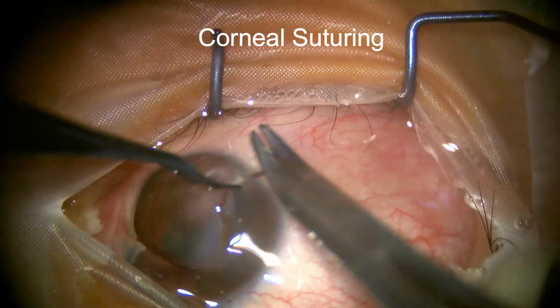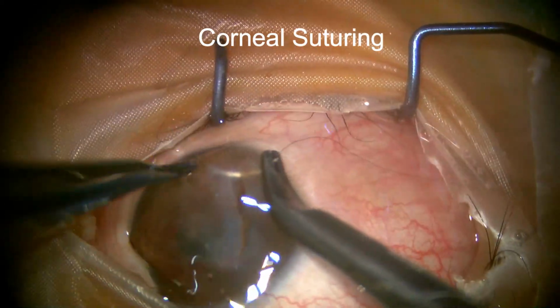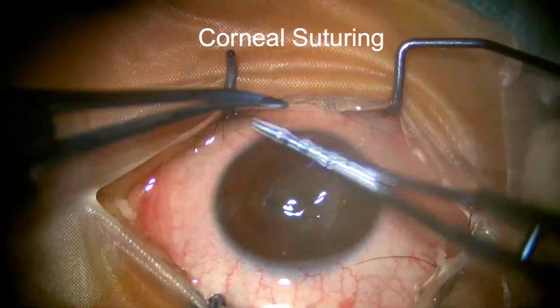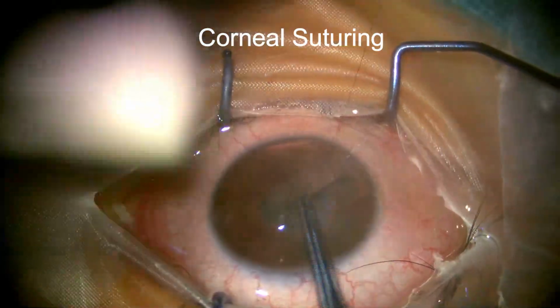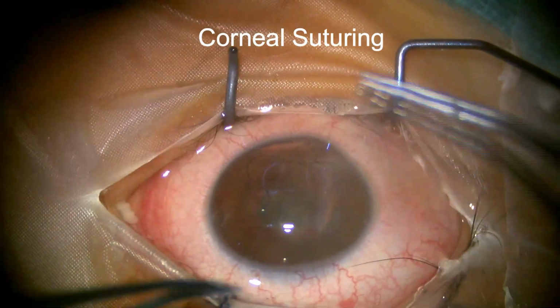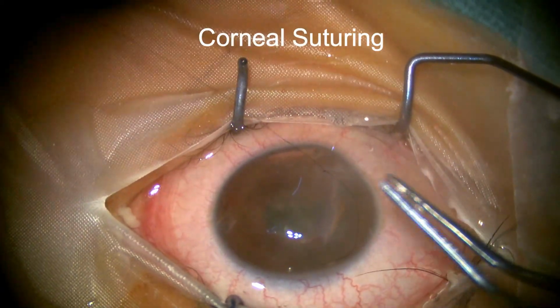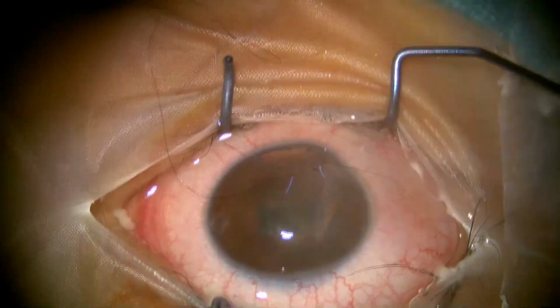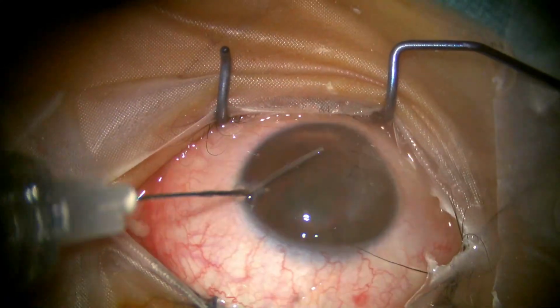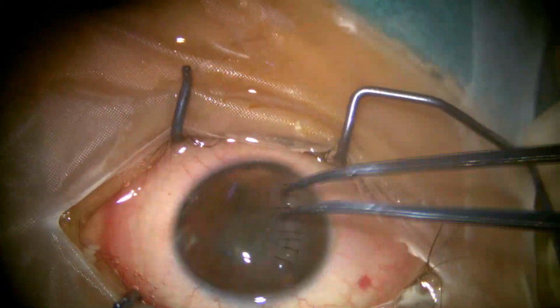Corneal suturing is started using 10-0 nylon with reverse cutting needle following adequate depth and distance from the injury. Sutures are tied and locked using 3-2-1 technique as depicted in the video. Anterior chamber is maintained throughout the procedure. All knots which were formed are now buried.